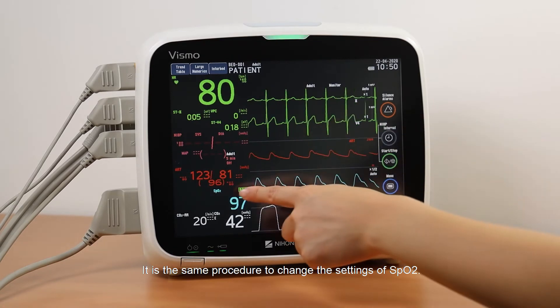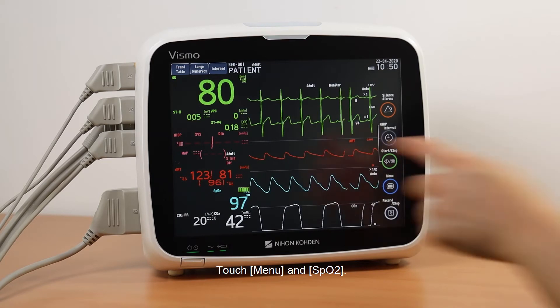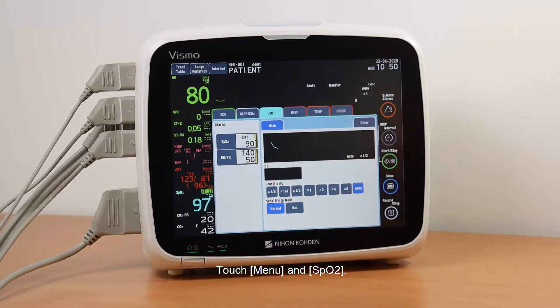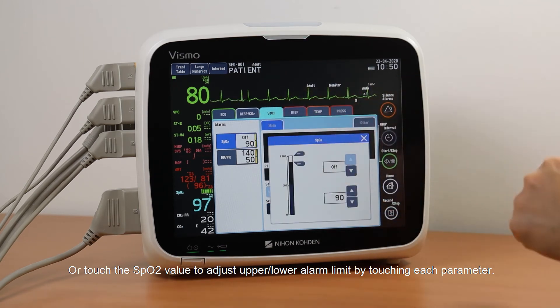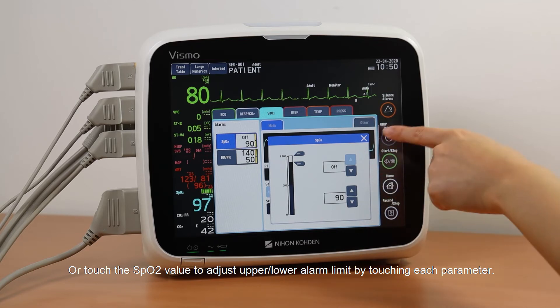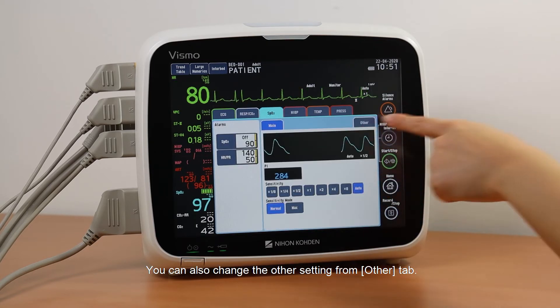It is the same procedure to change the settings of SpO2. Touch Menu and SpO2, or touch the SpO2 value to adjust the upper and lower alarm limits by touching each parameter. You can also change the other settings from the Other tab.